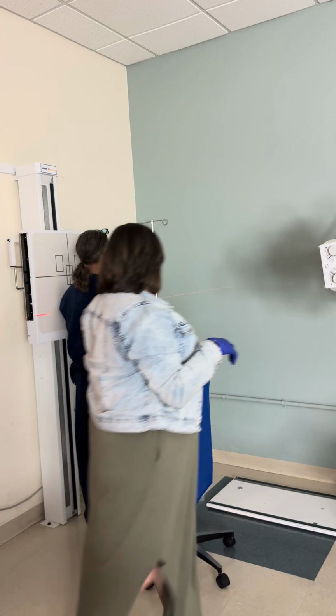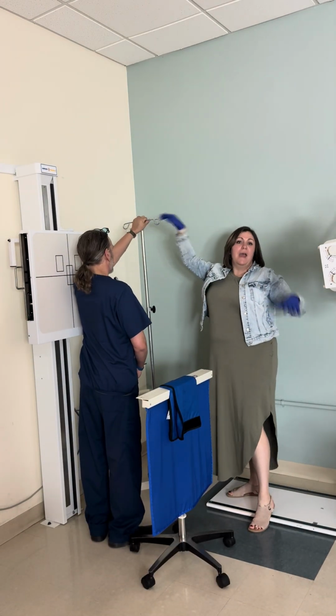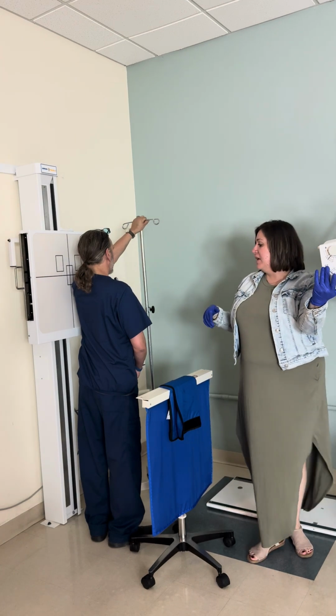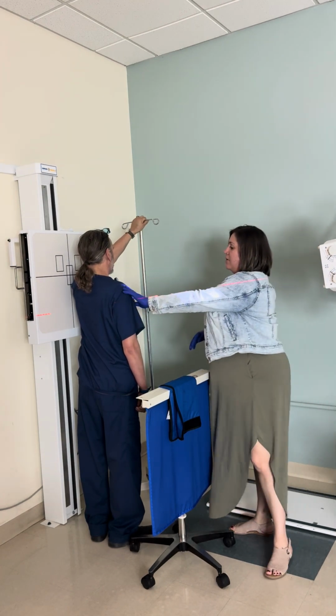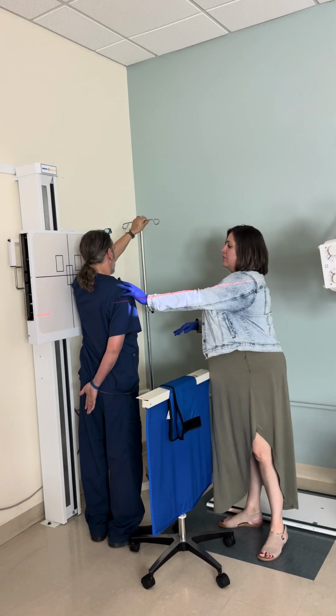So I like to have my patient bring their left arm up and place it on top of an IV pole or a handle that the x-ray tube will have. And then the right arm is gonna come down and back. So kind of like you're reaching into the back seat of the car. Try to relax it back.